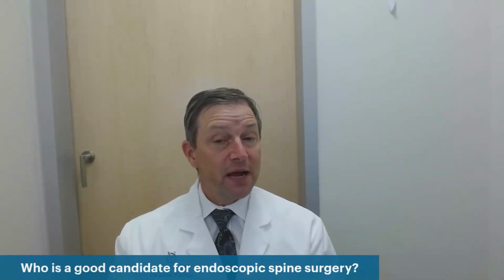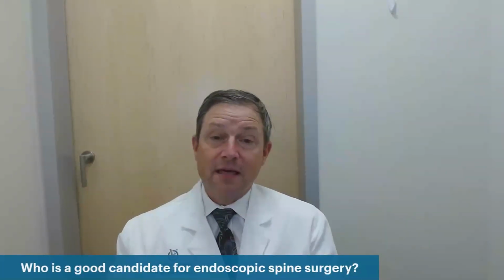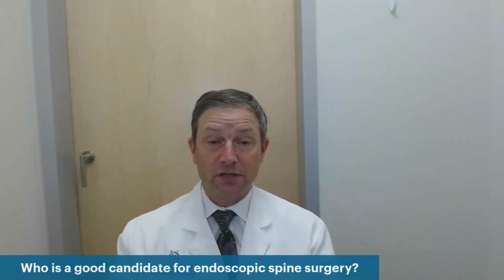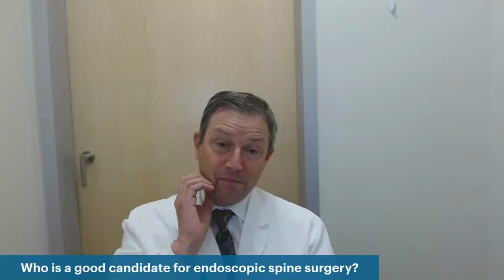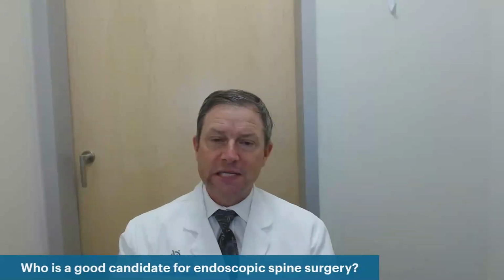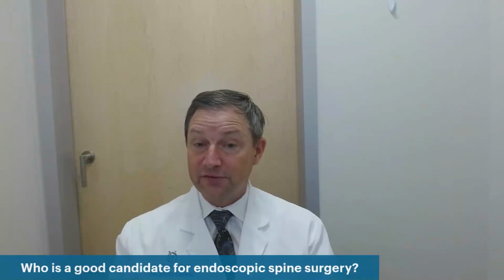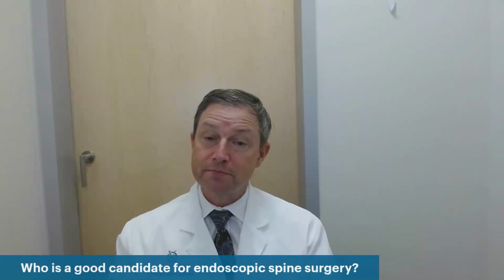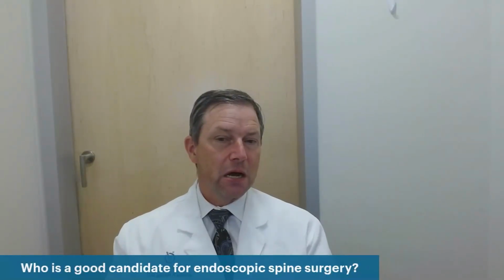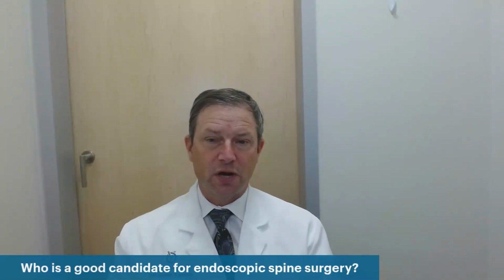So patients that want to get back to an active lifestyle and don't want a lot of downtime. Soft tissue disc herniations are in general easier to pluck out than bony impingement, although you can do bony work with the endoscope. It just takes a little bit longer. The bony overgrowth or osteophytes that can develop in the foramen are harder to remove with the endoscope. But I would say younger patients that want quicker recovery and less downtime, with soft tissue disc herniations. Great question. Next question.